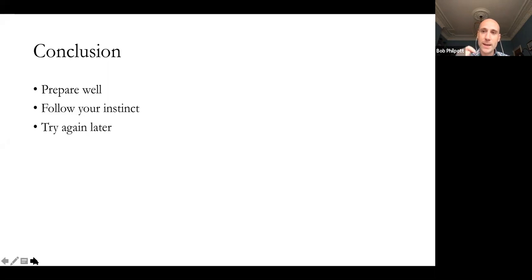And the last thing I will say is there is an element of speed about it, and there will be an element of efficiency and speed, which will become more important when we go back to practice in a few weeks' time. I'm being optimistic, but I'm saying don't force the situation. Be prepared to stop, instrument what you have found already, dress with calcium hydroxide, take another look the next time, and accept that, as I said earlier, over the course of a season or over the course of a year, these things will even themselves out. But if you adopt the correct principles, and if you adopt the same or similar techniques for each case, you will get better and quicker and more efficient and more predictable in terms of your access.